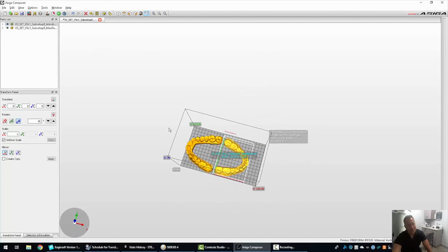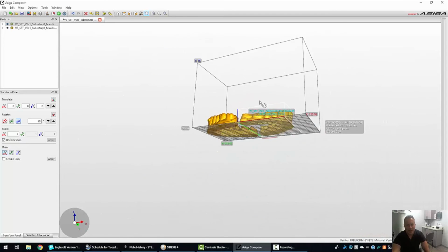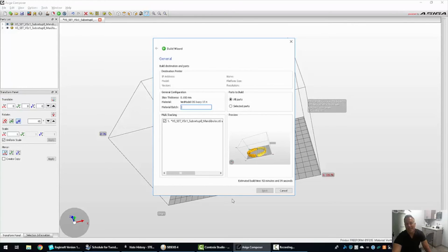So as you can see, there's a lot of other software out there that makes things a little easier when we come to place. Now when we're ready to go ahead and print, we simply click on Build. And again, I hate to sound so critical, but we've got about 4 menus we have to jump through to get to it.